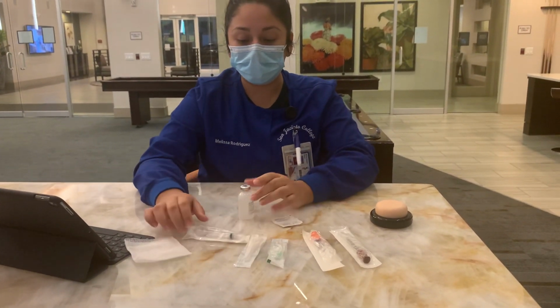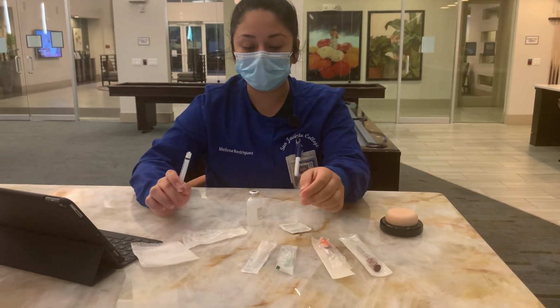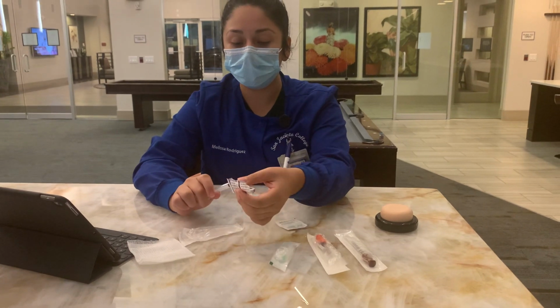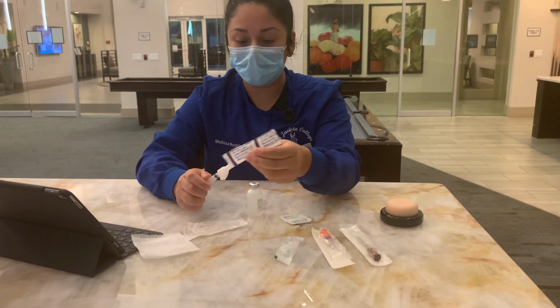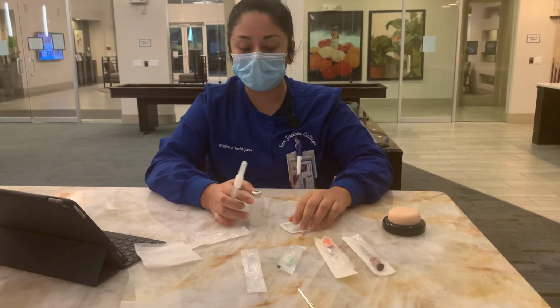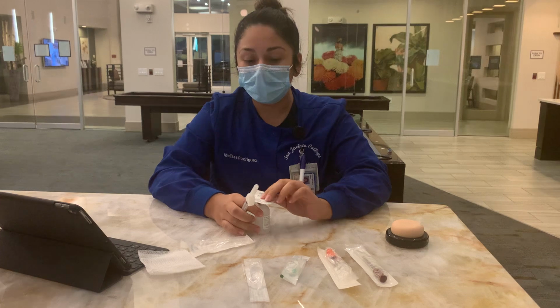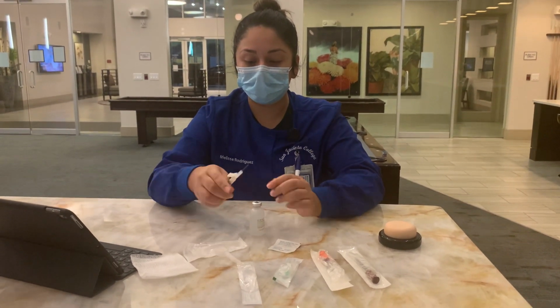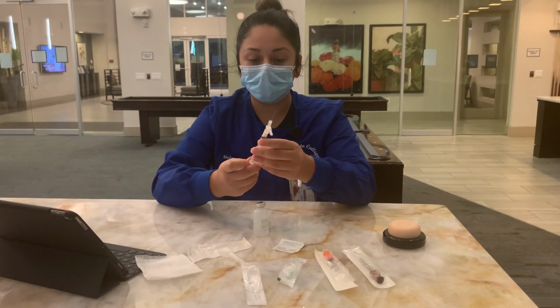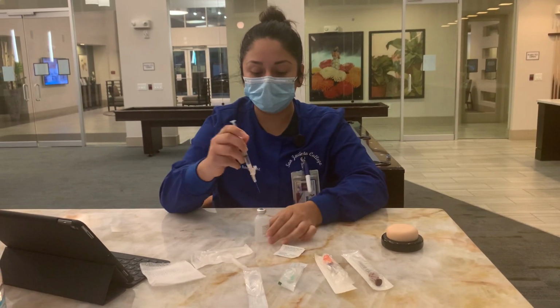So for IM, I'm going to go ahead and grab my 3 ml syringe and attach it to the needle. I'm going to remove the cap of my vial and clean it for 10 seconds with an alcohol swab. Once I've done that, I'm going to remove the cap to my needle. I'm gonna draw 1 ml of air back and insert it into the vial.